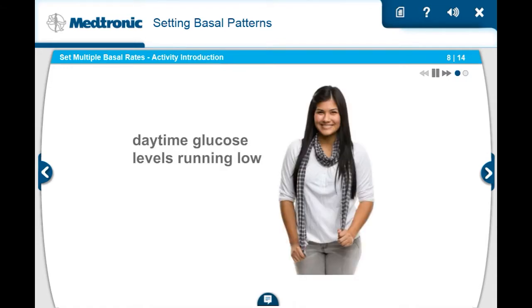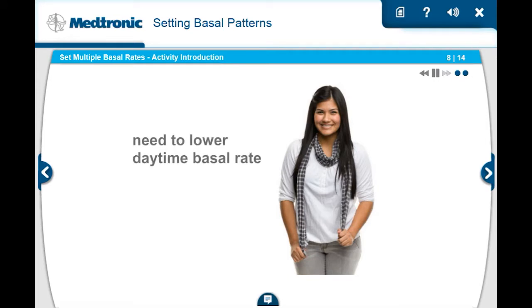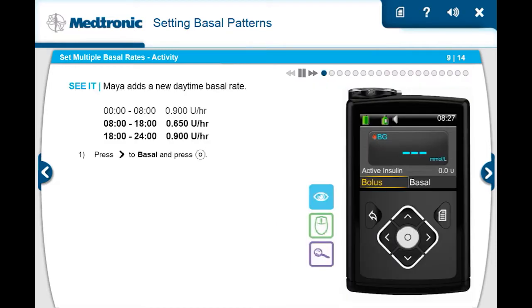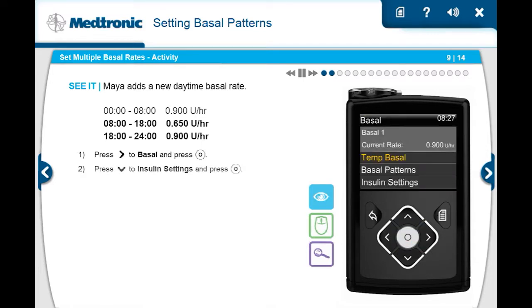According to Maya's doctor, the basal rate of 0.900 units per hour seems to be working well during the night, but during the day her glucose levels are running low. She needs to lower the basal rate from 0.900 to 0.650 units per hour between 8 a.m. and 6 p.m. To add the new rate, Maya presses right to basal and then selects it, then down to insulin settings and selects it.